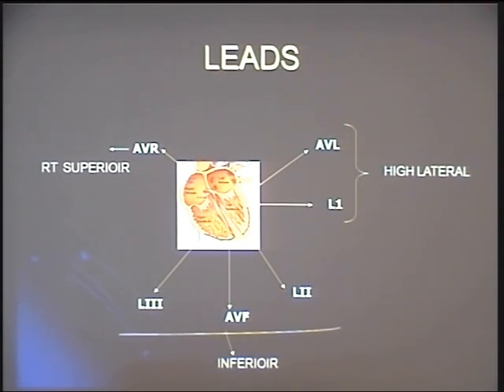Rather than saying L2, L3, AVF. When you say L2, L3, AVF, I know you did not understand the inferior leads. When you say L2, AVF and L3, I know you know the position of the leads: from inferior left, vertical, and inferior right.